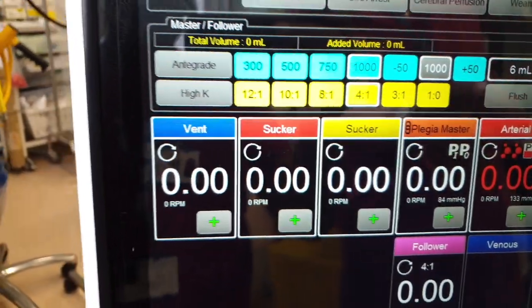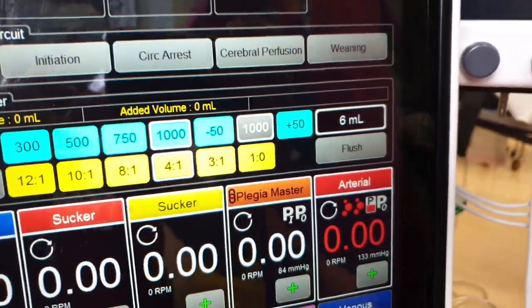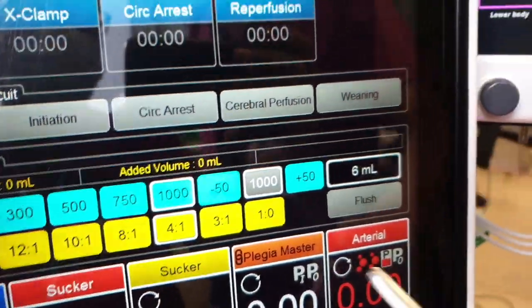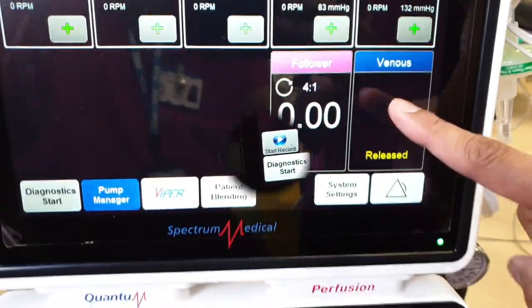And then the volume is written here. When you're flushing, you just push the flush mode, then it doesn't count. If you don't hit the flush, it will count as cardioplegia, but you can edit it later. For the venous occluder, yeah?